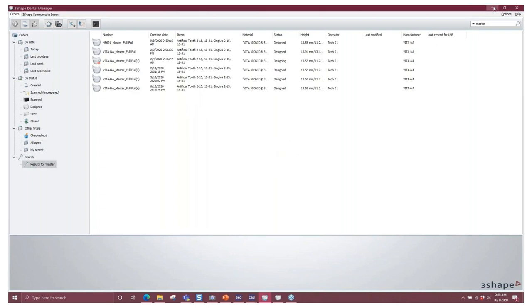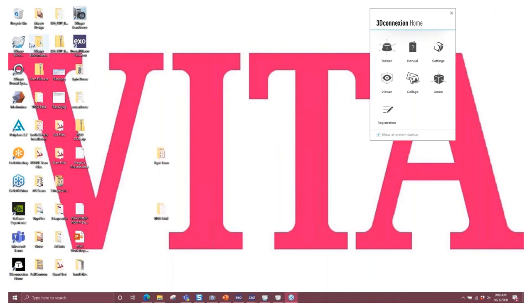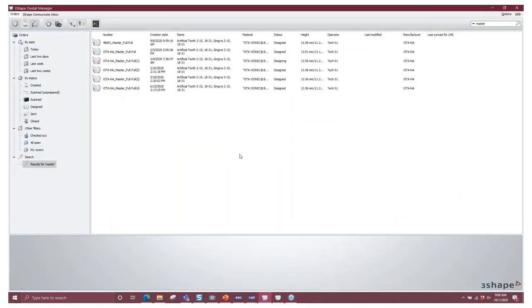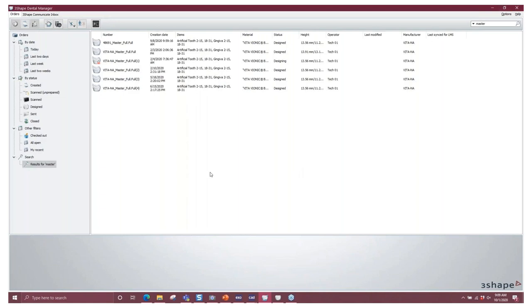This also works on a server setup. If you have several other designers working, they can continue to design. Just remember that once they're done designing and save, they will have to restart their Dental Manager for those changes to take place. Once you've imported it, saved it, and restarted your Dental Manager, the library will be available for use — you don't have to get any files from me or 3Shape; you can do it directly from your system.